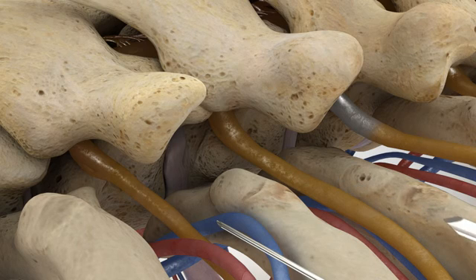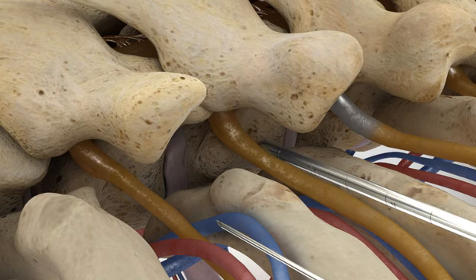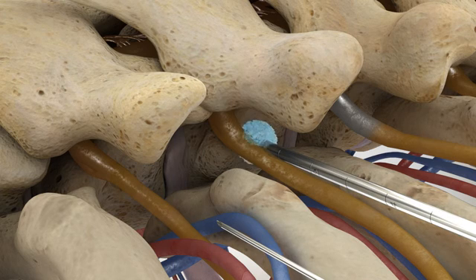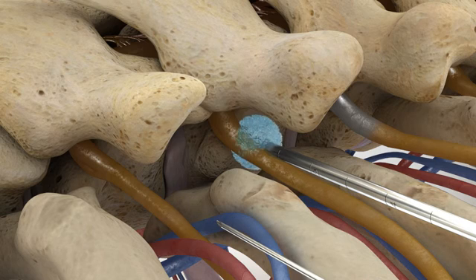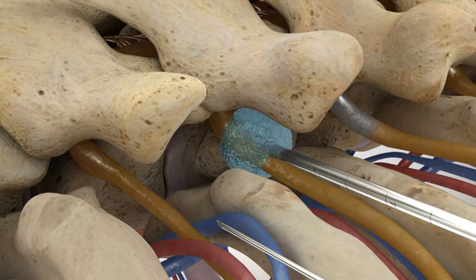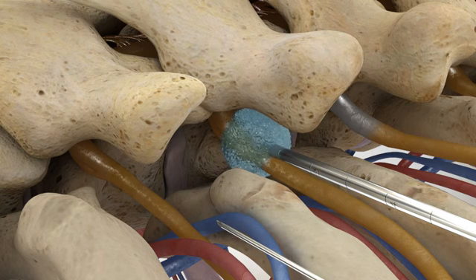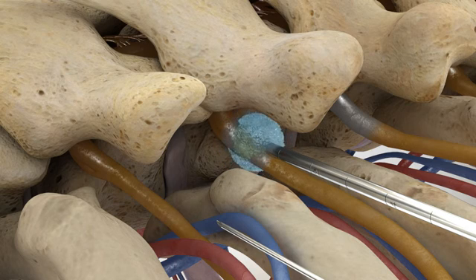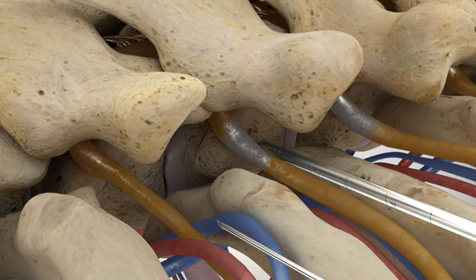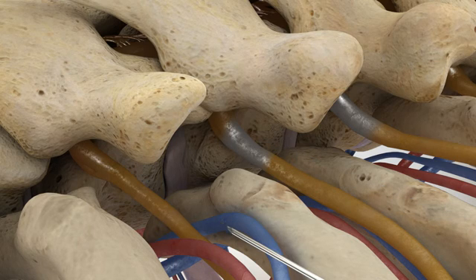The procedure is repeated for all of the affected nerves. The number of nerves to be ablated is determined based on patient response to prior nerve blocks. It is important to confirm the position of each needle and cryoprobe with a CT scan after insertion. Their positioning is based on anatomical landmarks and avoidance of intercostal arteries and veins.